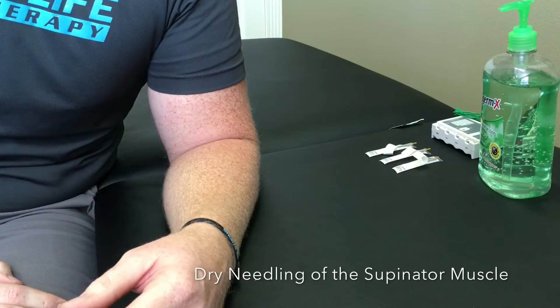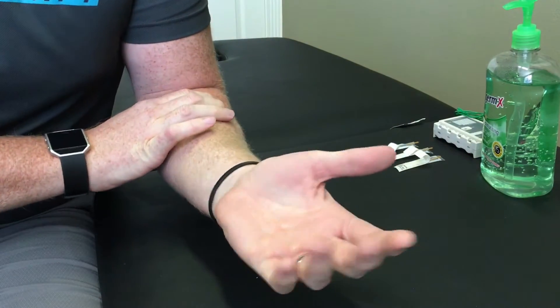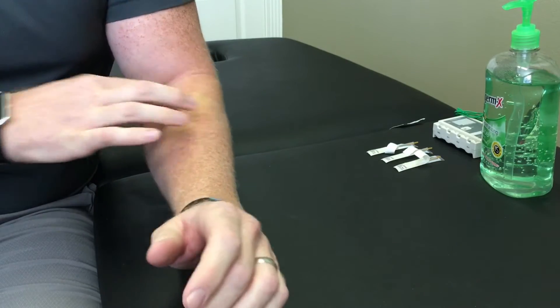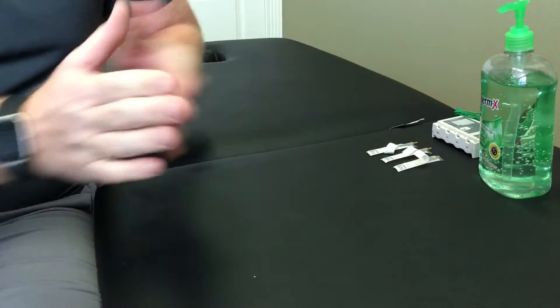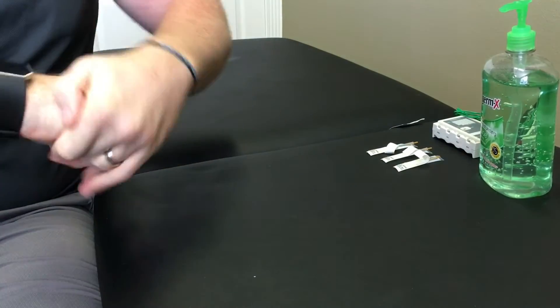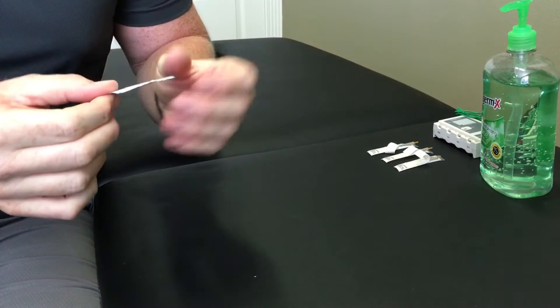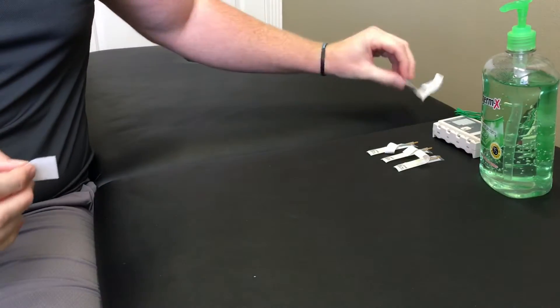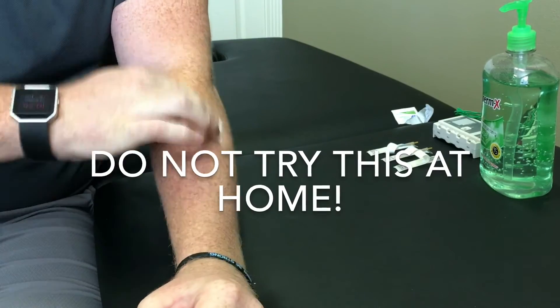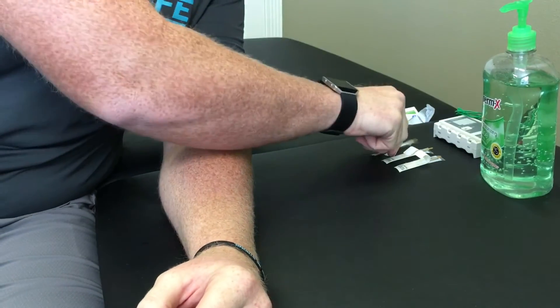The muscle I'm targeting is the supinator, which is the muscle responsible for this motion right here, and is located in the upper forearm. It has some trigger points right here that I'll be hitting. But first I'm going to sanitize the hands and prep the skin with an alcohol wipe, and let's go for it.